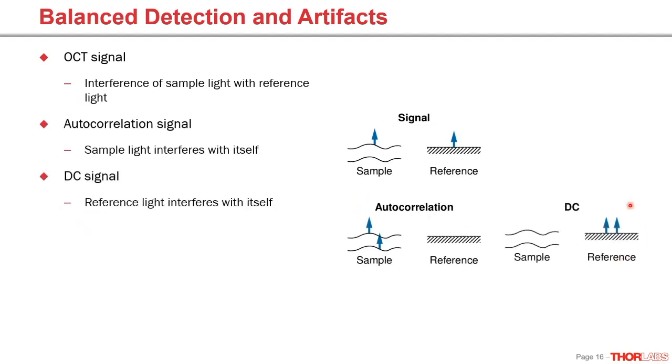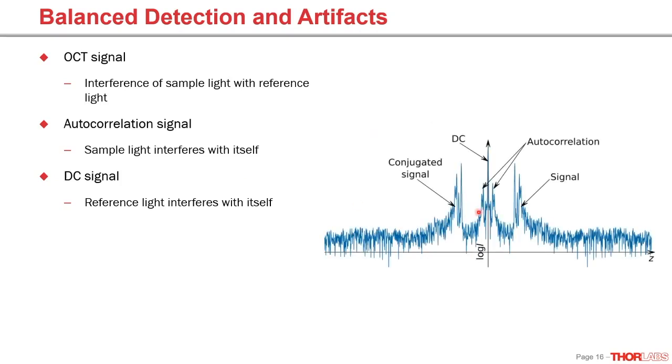And also, that's mostly the intensity of the reference light we observe, but we could also think of reference light interfering with reference light. And of course, we can have the roles of sample and reference light interchanged. Those will create 4 signals in each OCT scan. And in an SD system, this will look as follows.